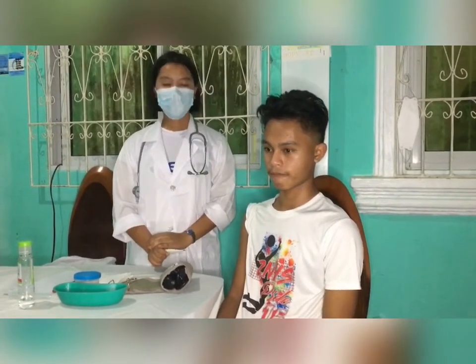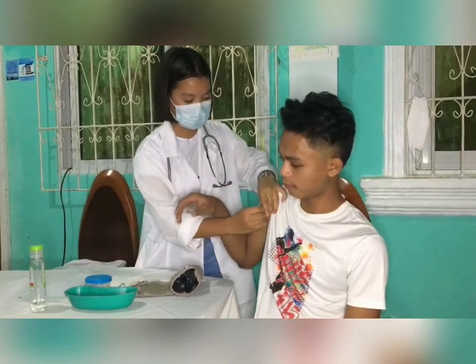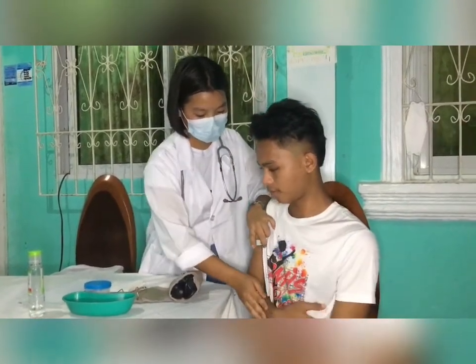Place the thermometer in the patient's axilla. Assist the patient to place the arm tightly across the abdomen to keep the thermometer in place. Wait until the thermometer buzzes.